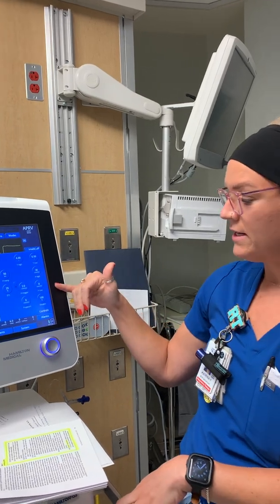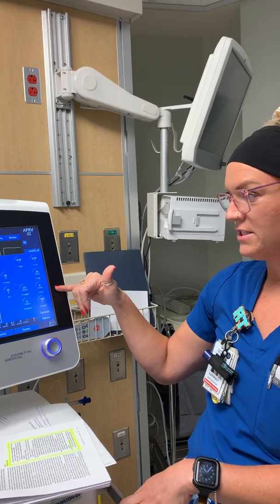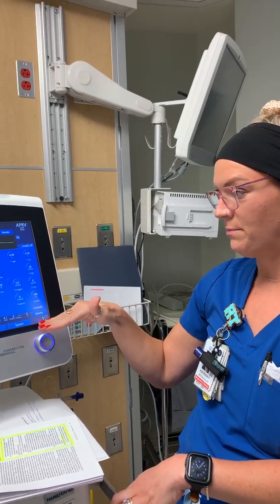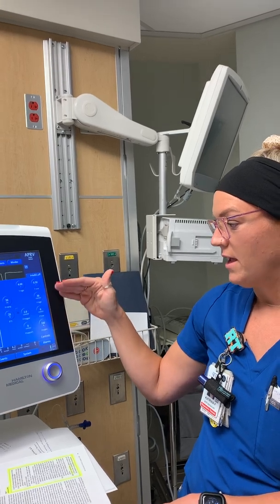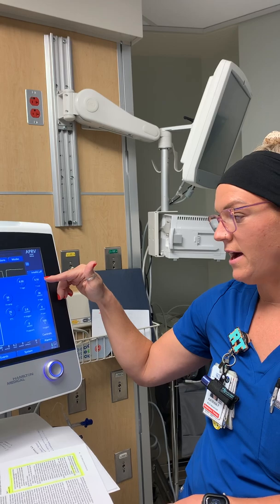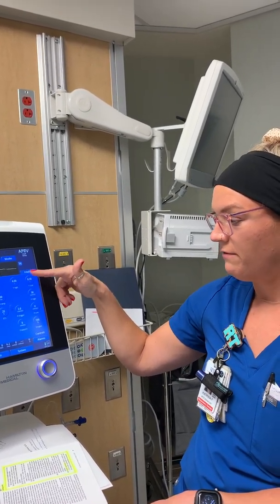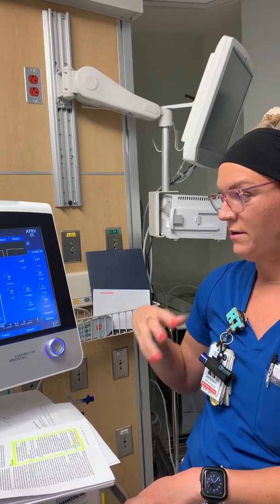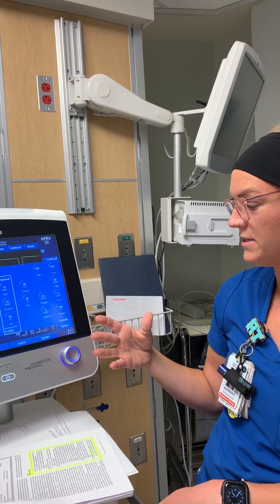Your P low is going to be zero. The patient never actually reaches zero P because there's just not enough time during that release — that's your PEEP at exhalation. Your T high is the time spent at the high PEEP; start about four to seven seconds to give a backup rate so the patient can get rid of some CO2.